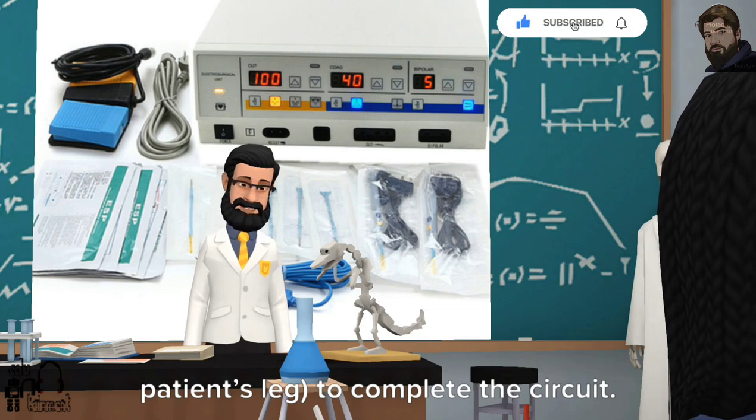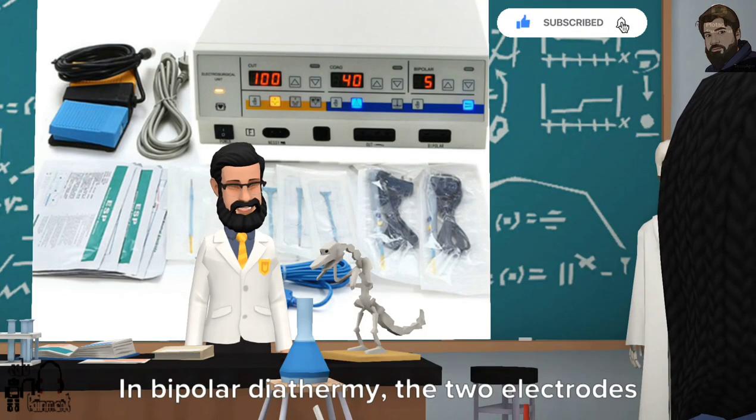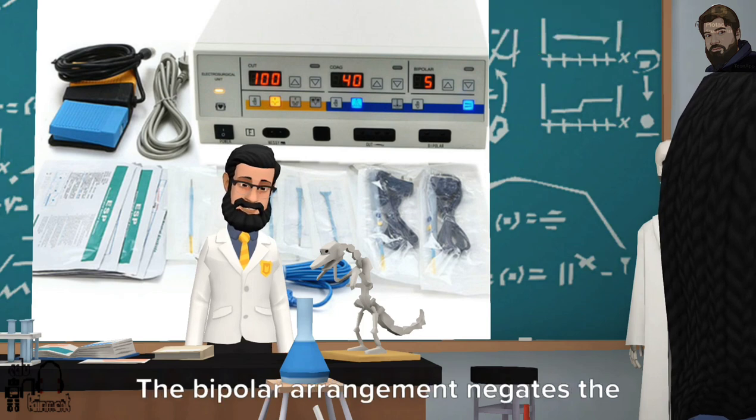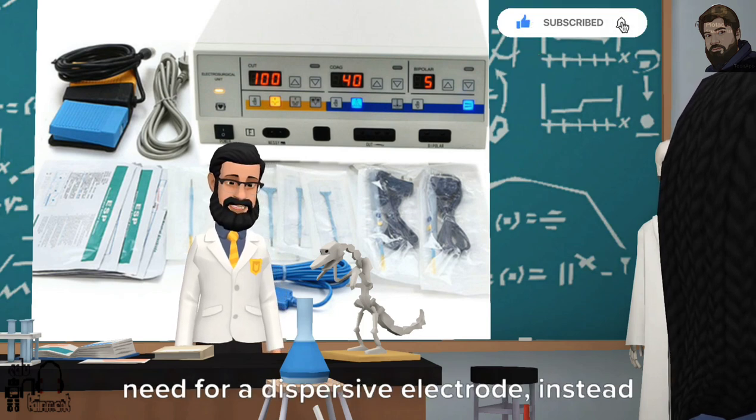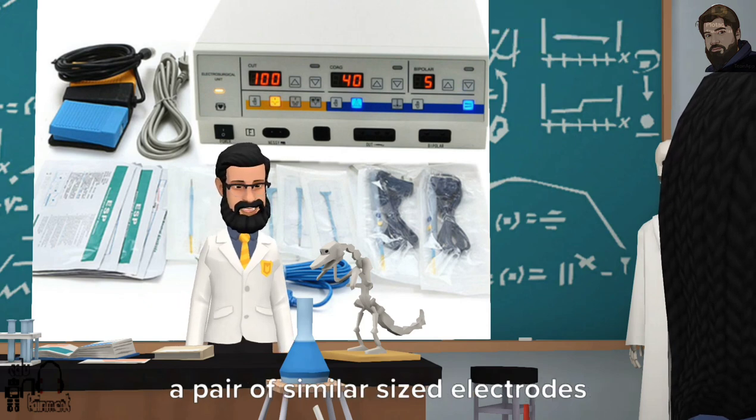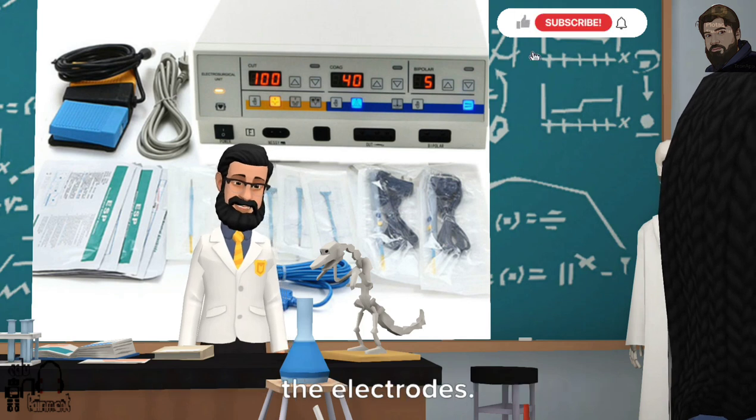What is bipolar? In bipolar diathermy, the two electrodes are found on the instrument itself. The bipolar arrangement negates the need for a dispersive electrode; instead a pair of similar sized electrodes are used in tandem. The current is then passed between the electrodes.